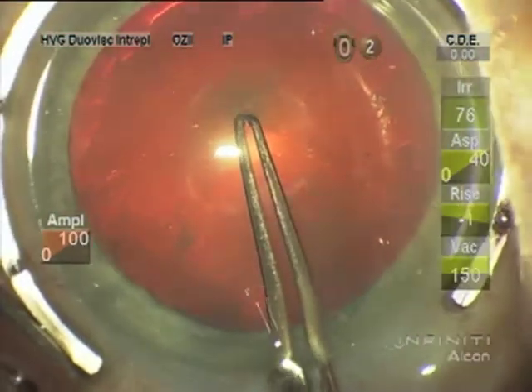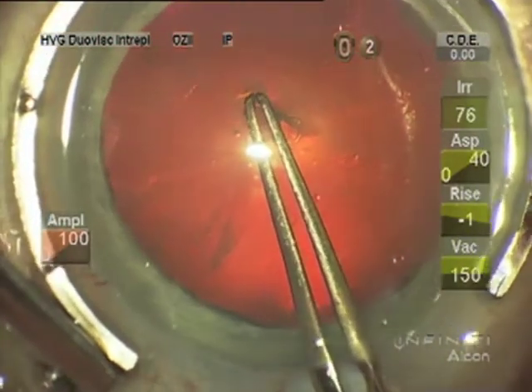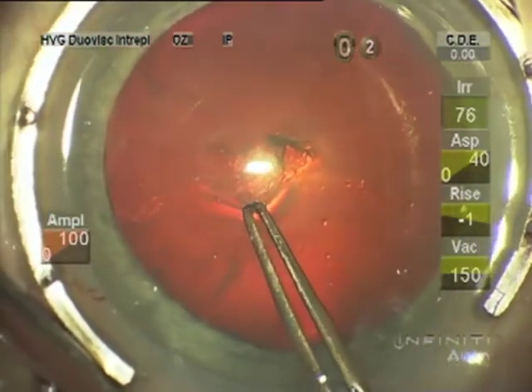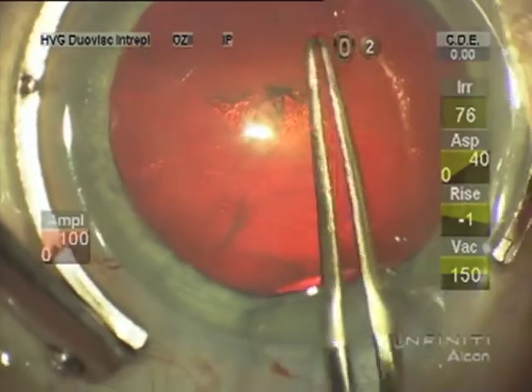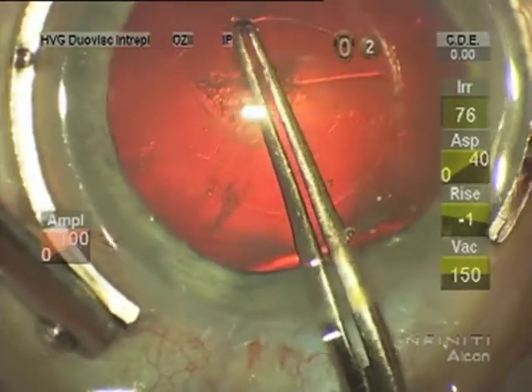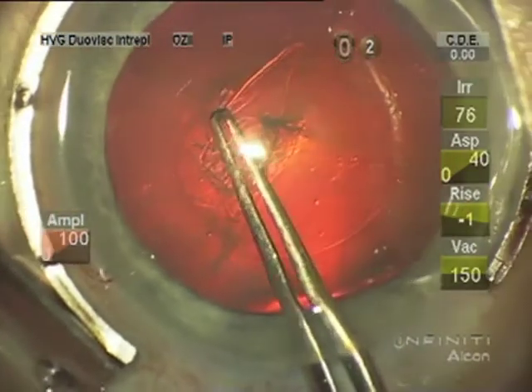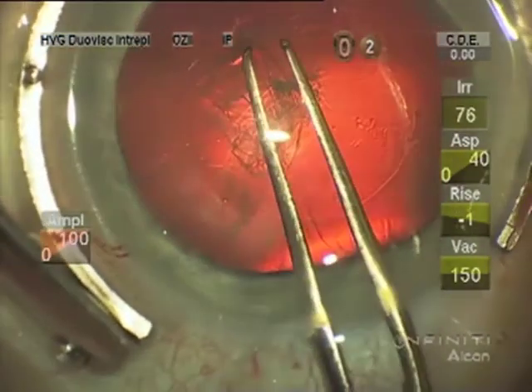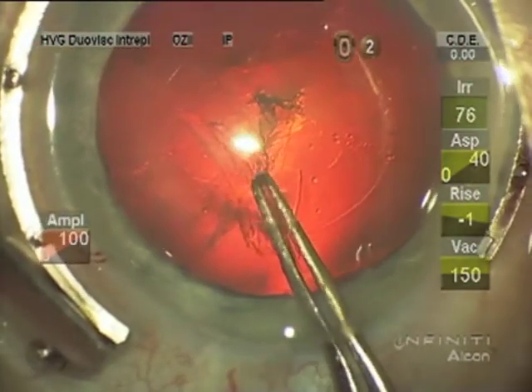I start the capsulorhexis with these forceps in most cases, but in young people and loose zonules and so forth it takes a cystotome to start. I like to make the capsulorhexis about five millimeters in diameter and make sure that I have anterior capsule covering the optic.